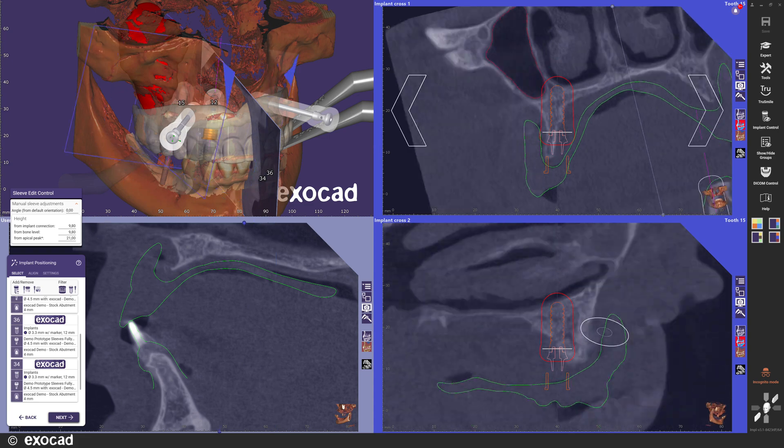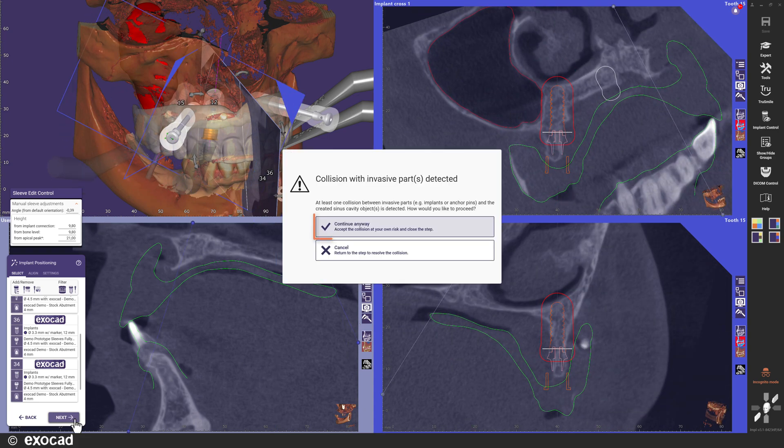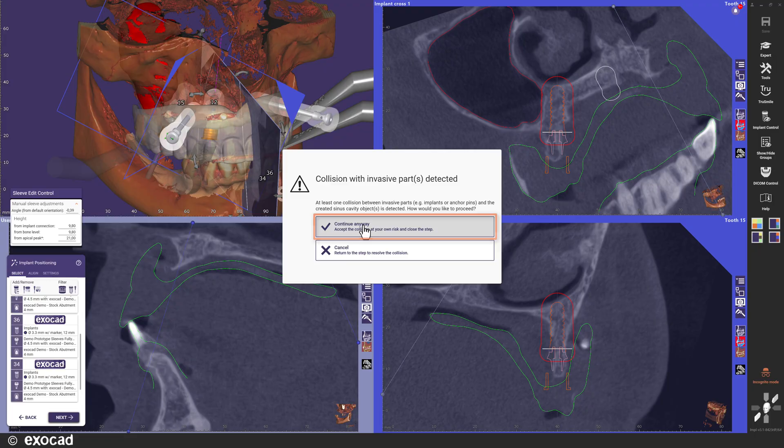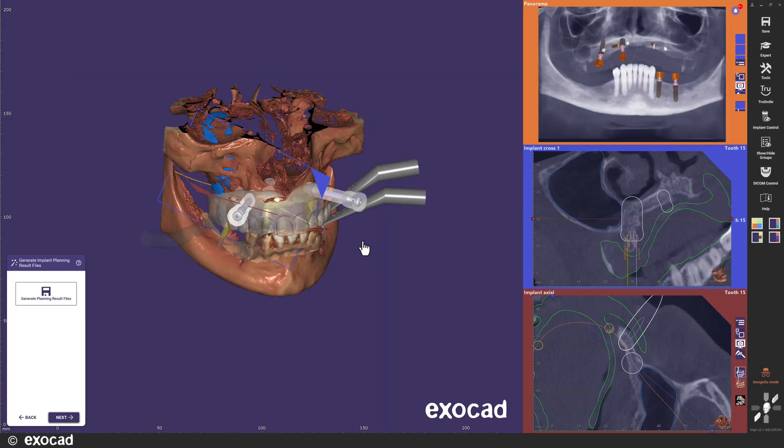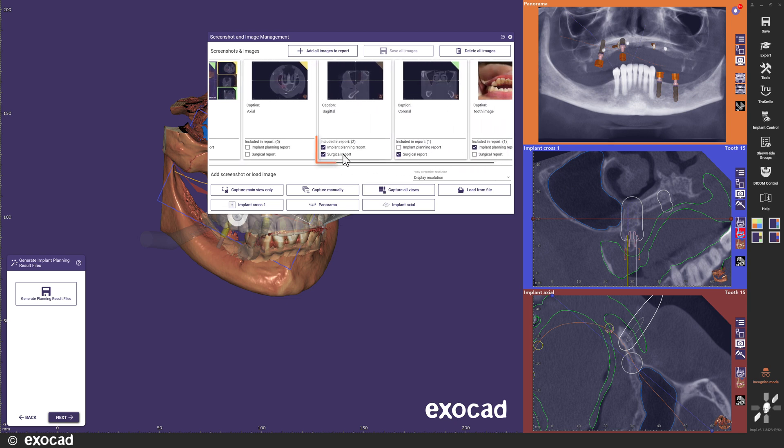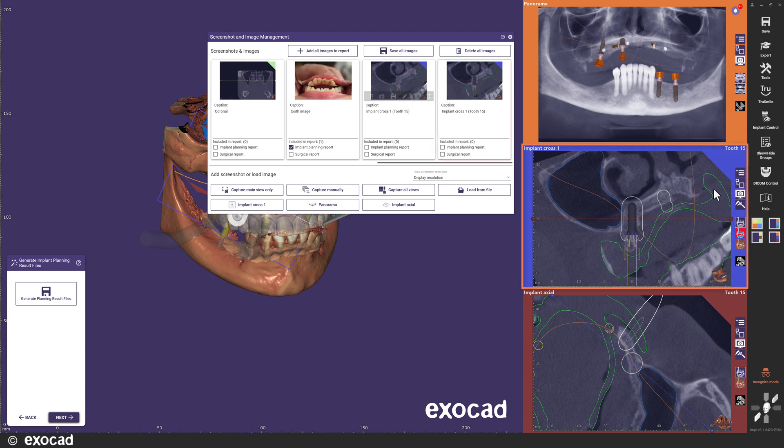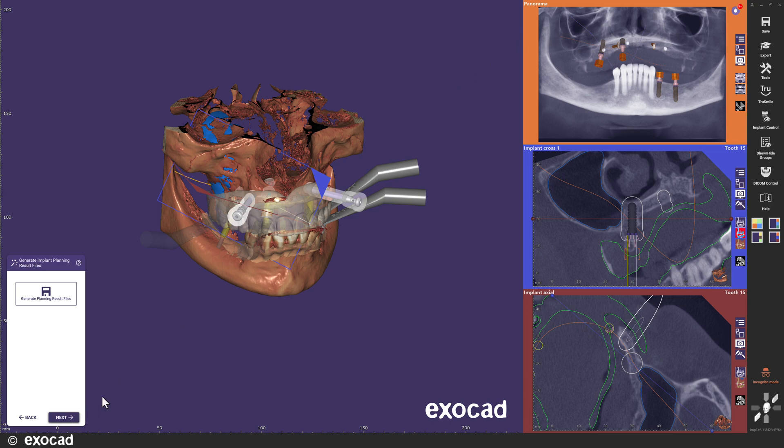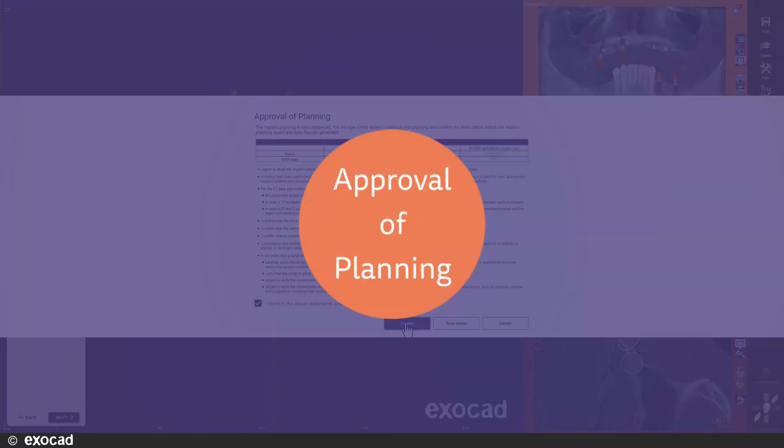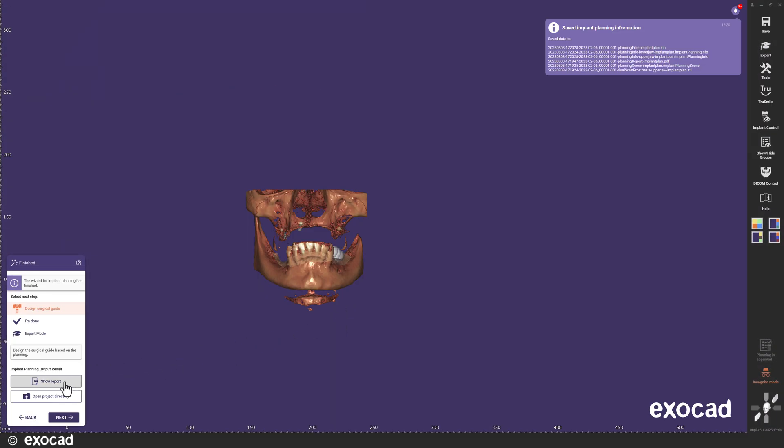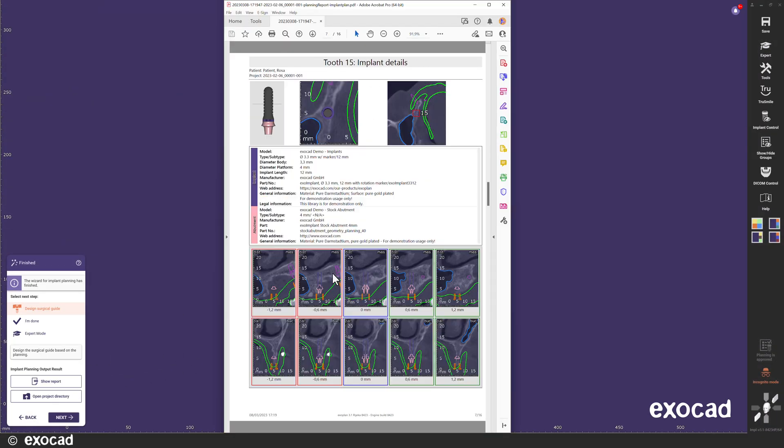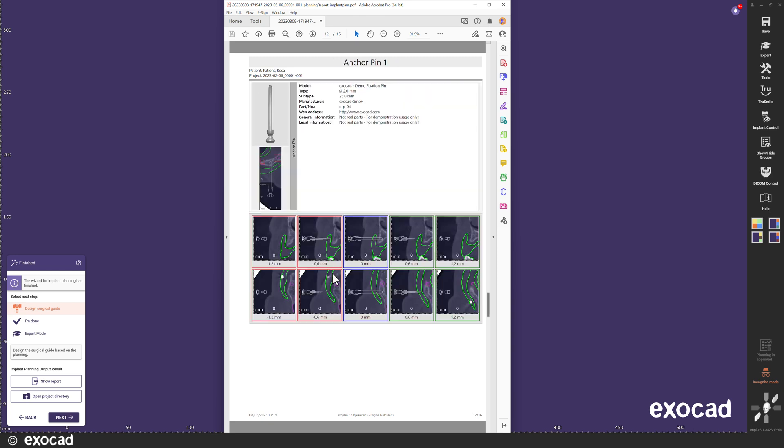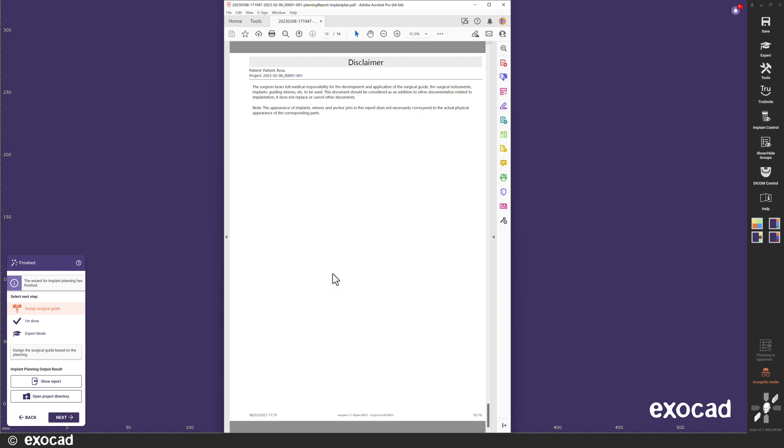In Exoplan 3.1 Rijeka, you can continue even if you have a collision with the sinus object. Before I start to generate the result files, I get the chance to check that the screenshots I marked to add in the reports are still up to date. Since I changed the position of the implant after these screenshots were made, I will remove them from the report, make a note and add a new screenshot of the current situation. Now it is time to approve the planning and generate the implant planning result files. When we look at the implant planning report, we can see some enhancements to the layout and at the end we have the screenshots that were selected for the implant planning report.